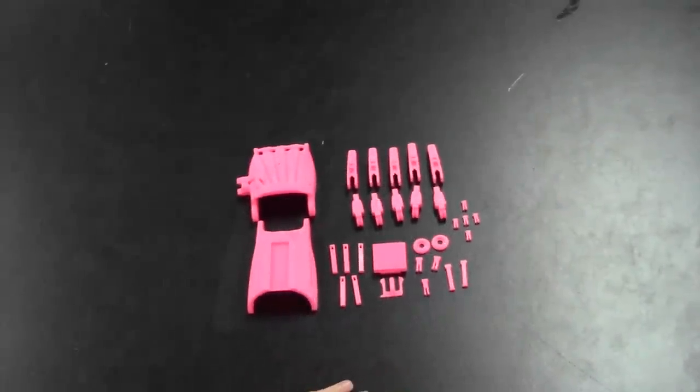Hello everyone. Today I'll be showing you the assembly of the plastic part one, which is laying out the parts.